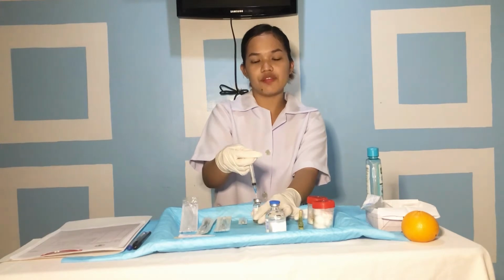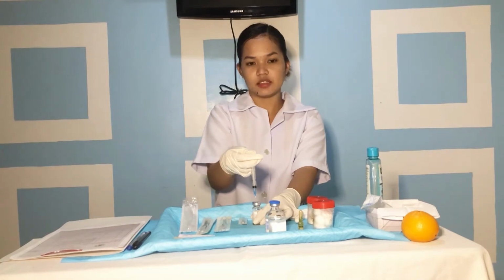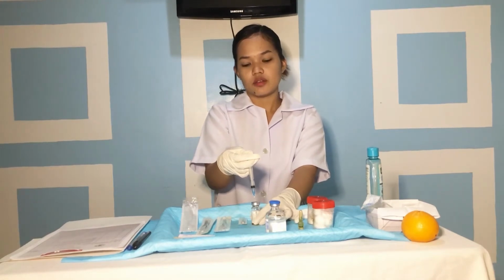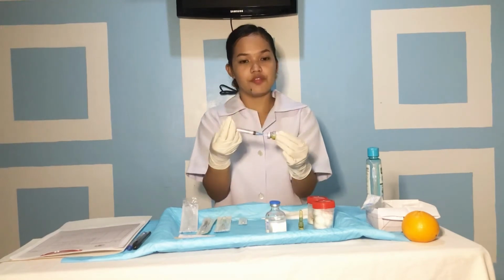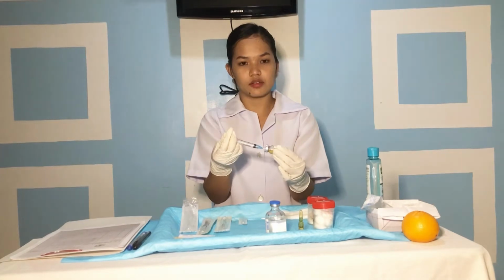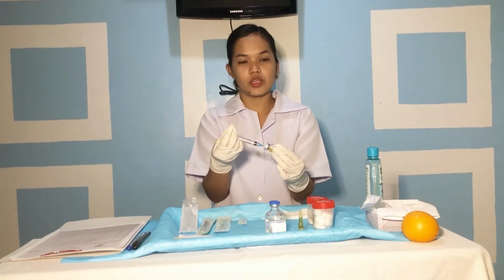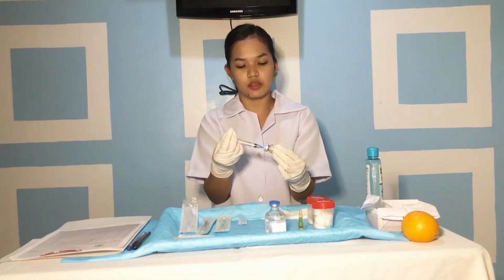Invert the vial while keeping a firm hold on the syringe and plunger. Hold the vial between the thumb and middle finger of the non-dominant hand. Inverting the vial allows the fluid to settle into the lower half of the container. Keep the tip of the needle below the fluid level.